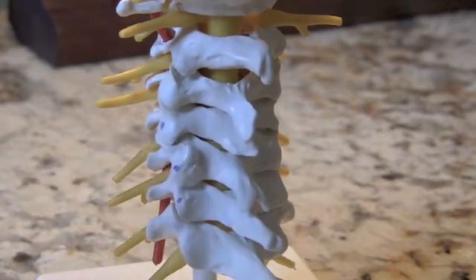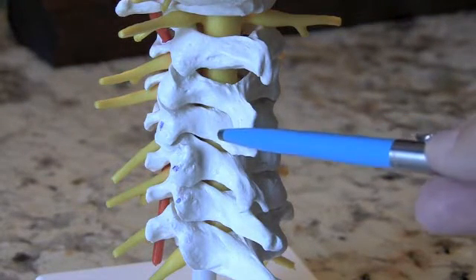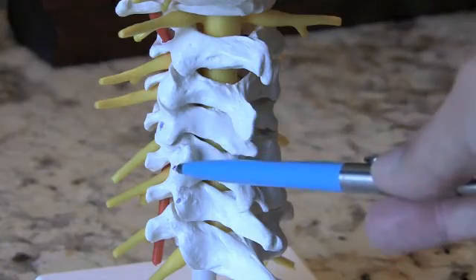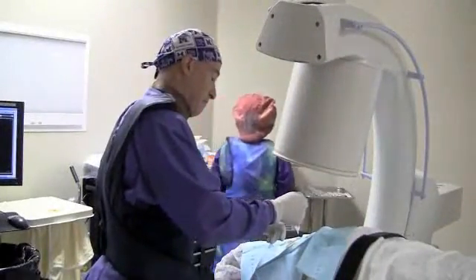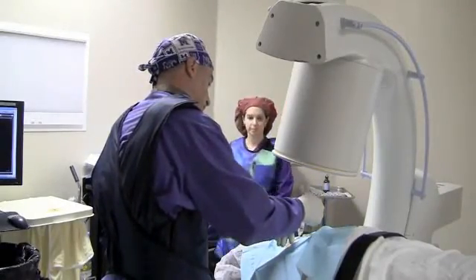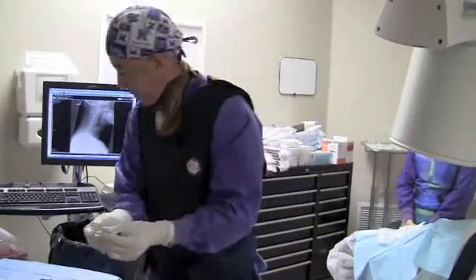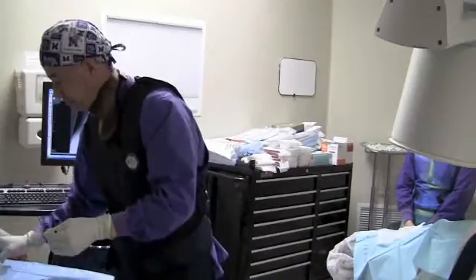By fluoroscopy, we're guiding a tiny 23-gauge needle down to try to block right here and right here. The needle that we use is very, very small — that's what we're going to inject with in the area.